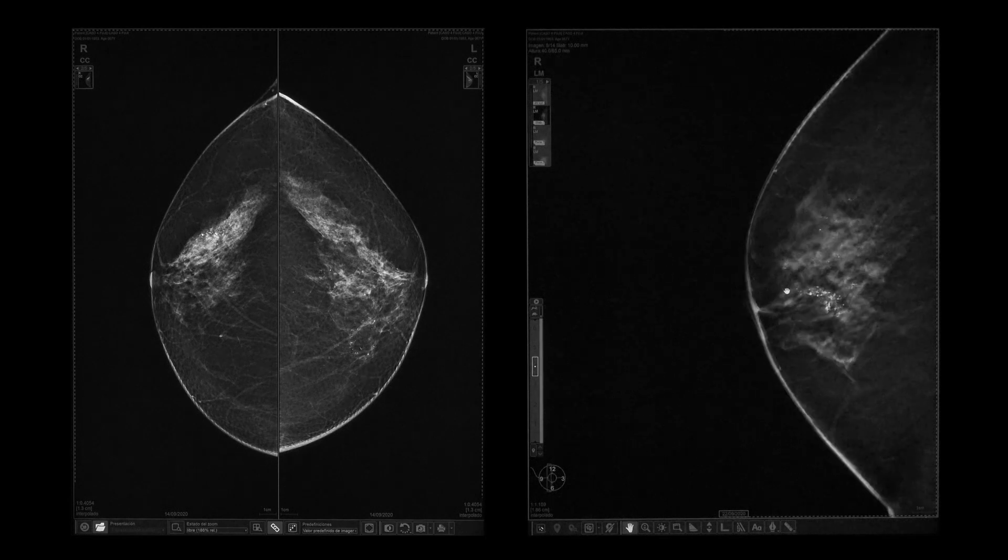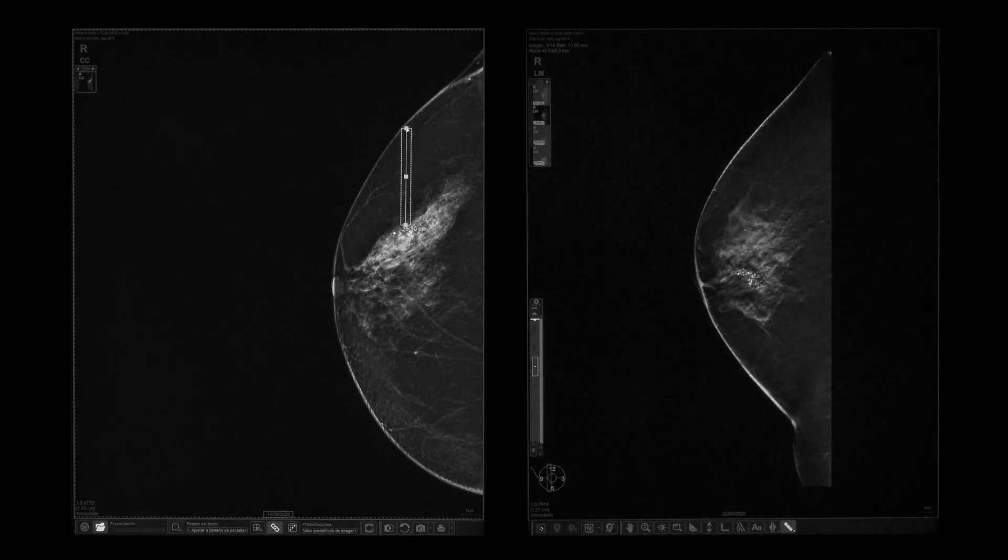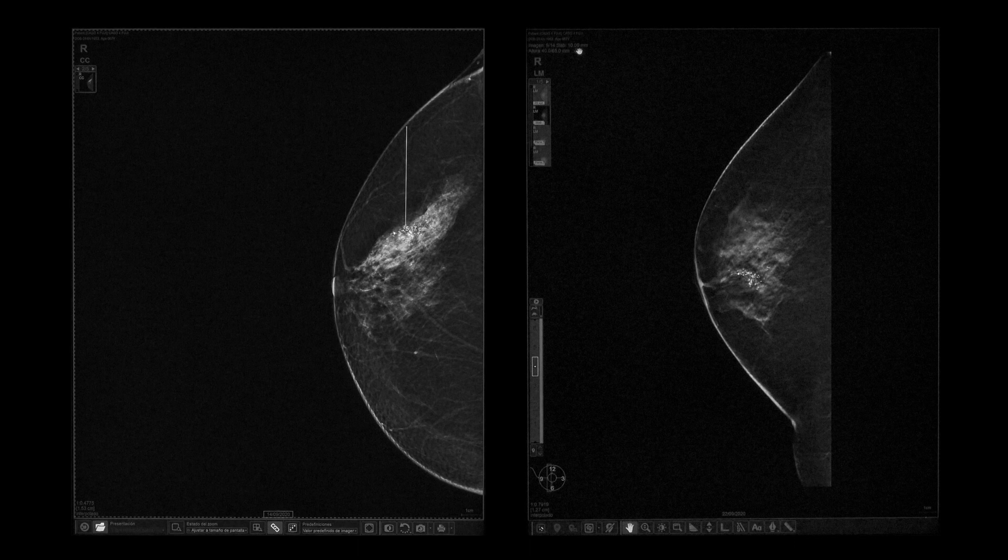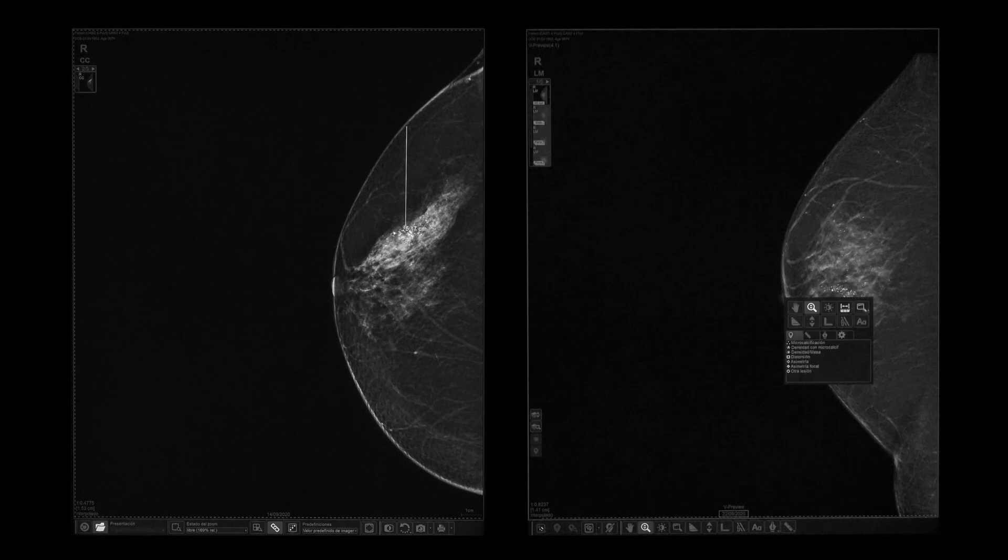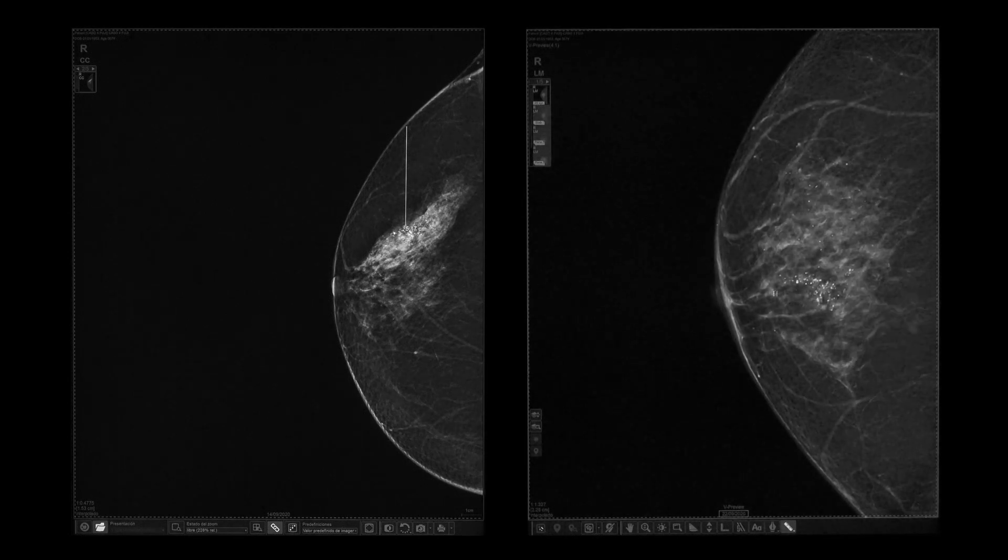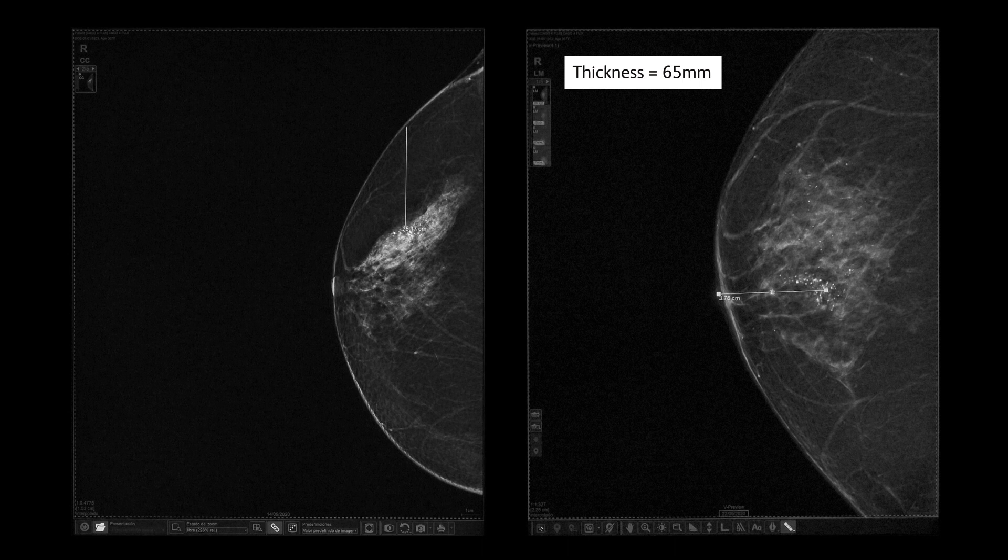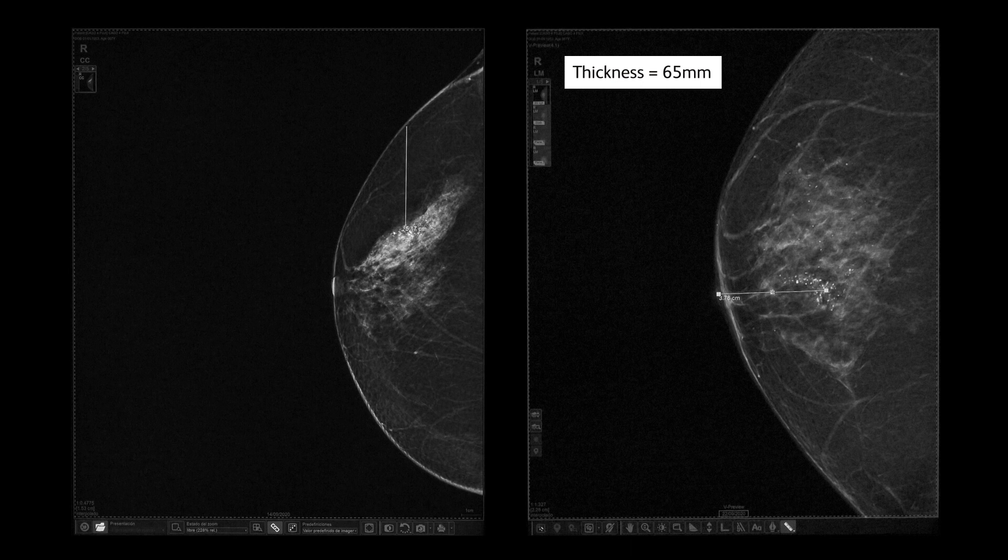To decide the best access, let's take a couple of measurements. In the cranio-caudal view, draw a straight line from the lesion to the skin, outer quadrant. This is 5.17 centimeters. Sitting position, horizontal approach, external access could be a possibility. In the lateral medial view, draw a straight line from the nipple to the lesion. This gives 3.78 centimeters. Since breast thickness would allow a vertical approach and considering patient comfort and shortest approach, lateral decubitus external access is selected.